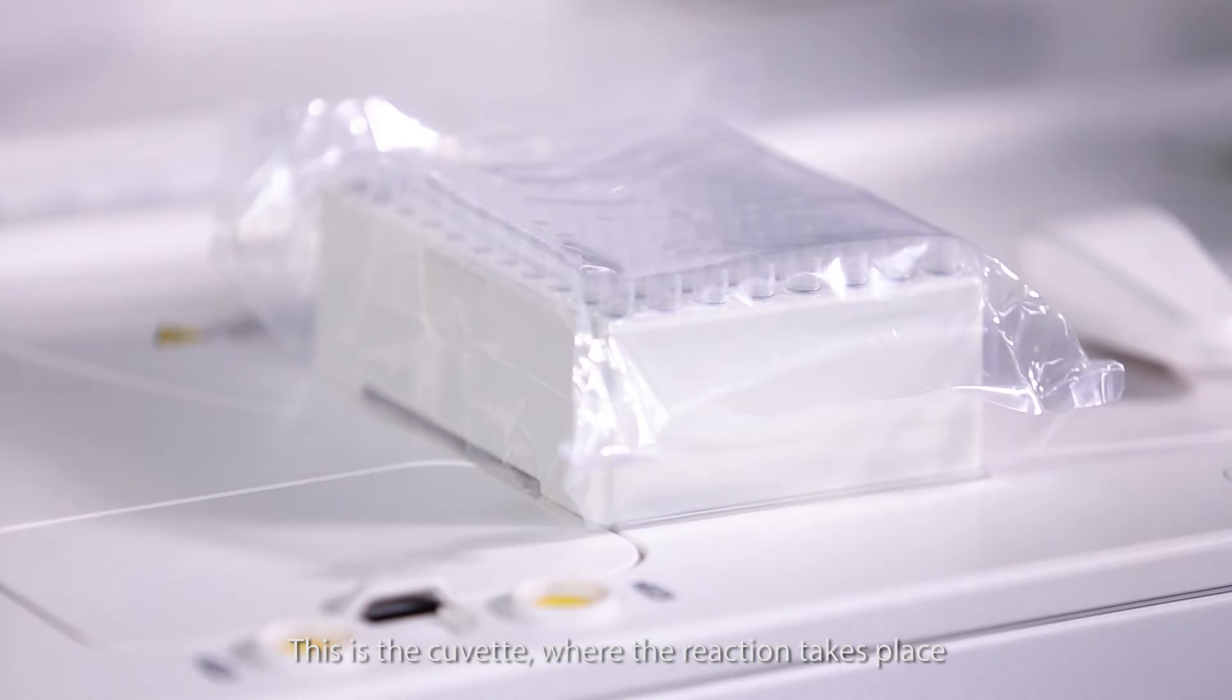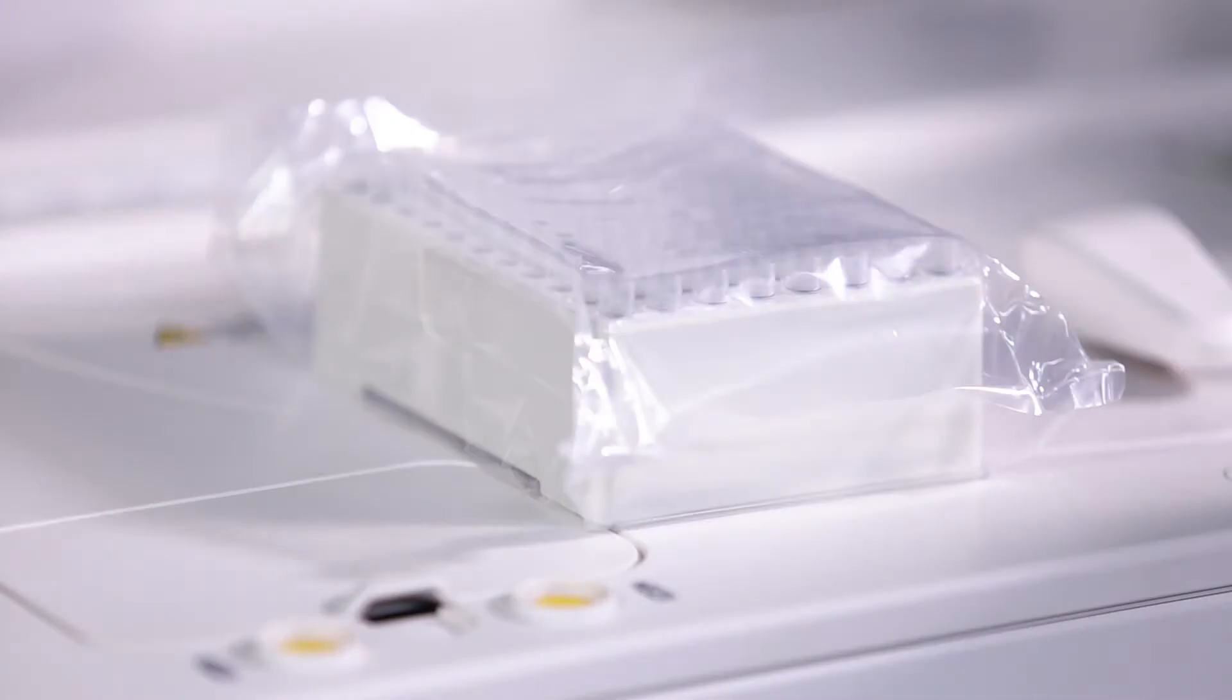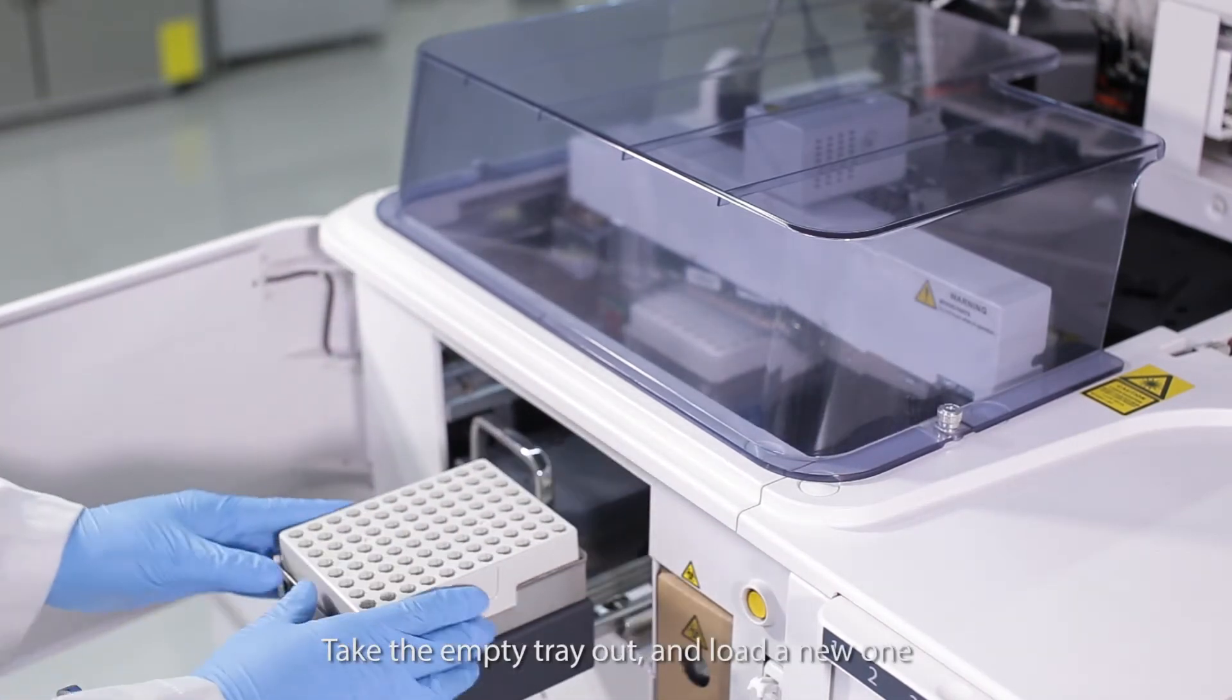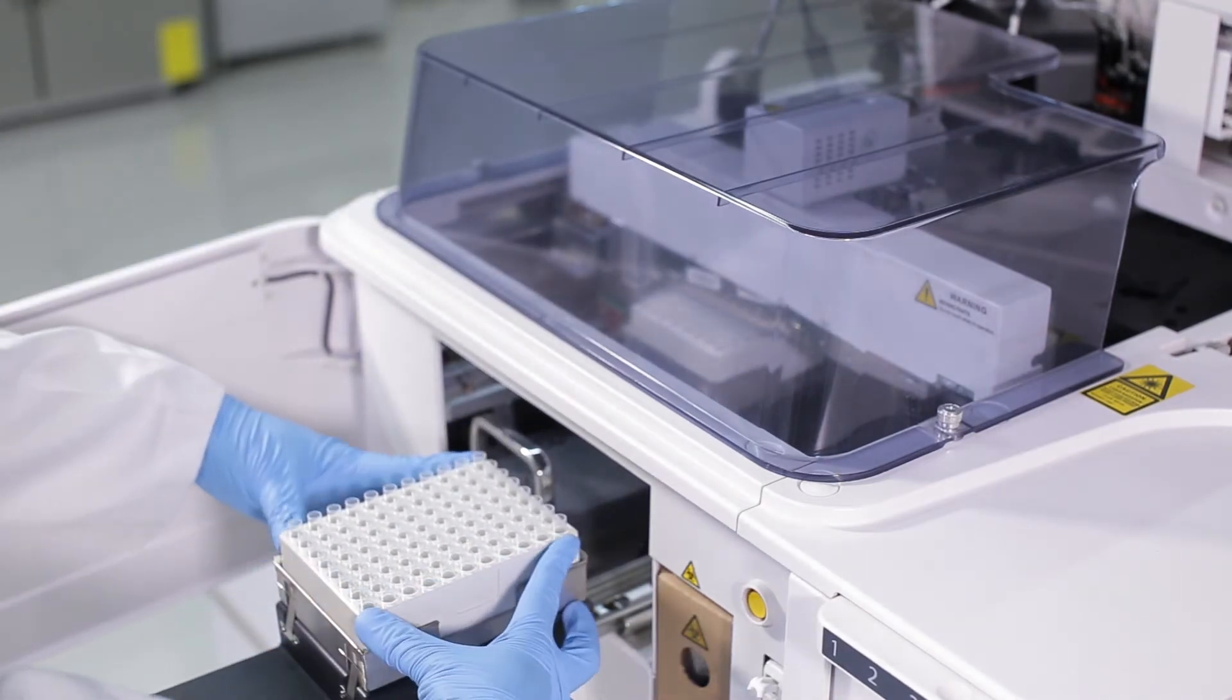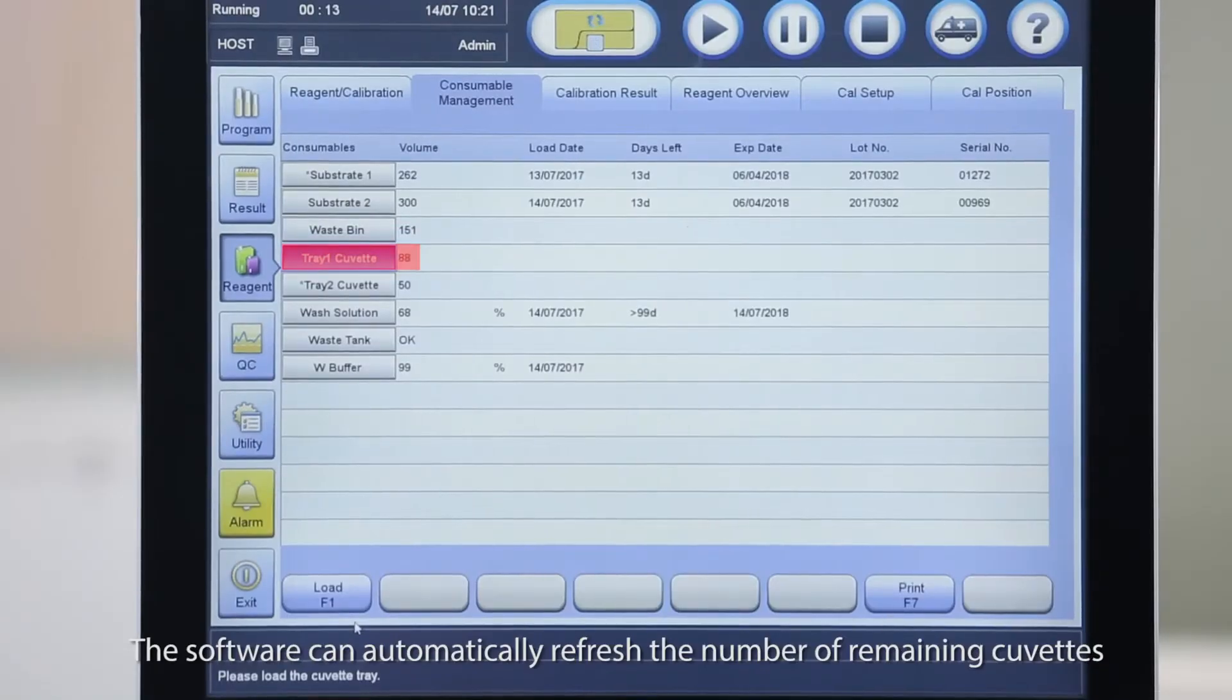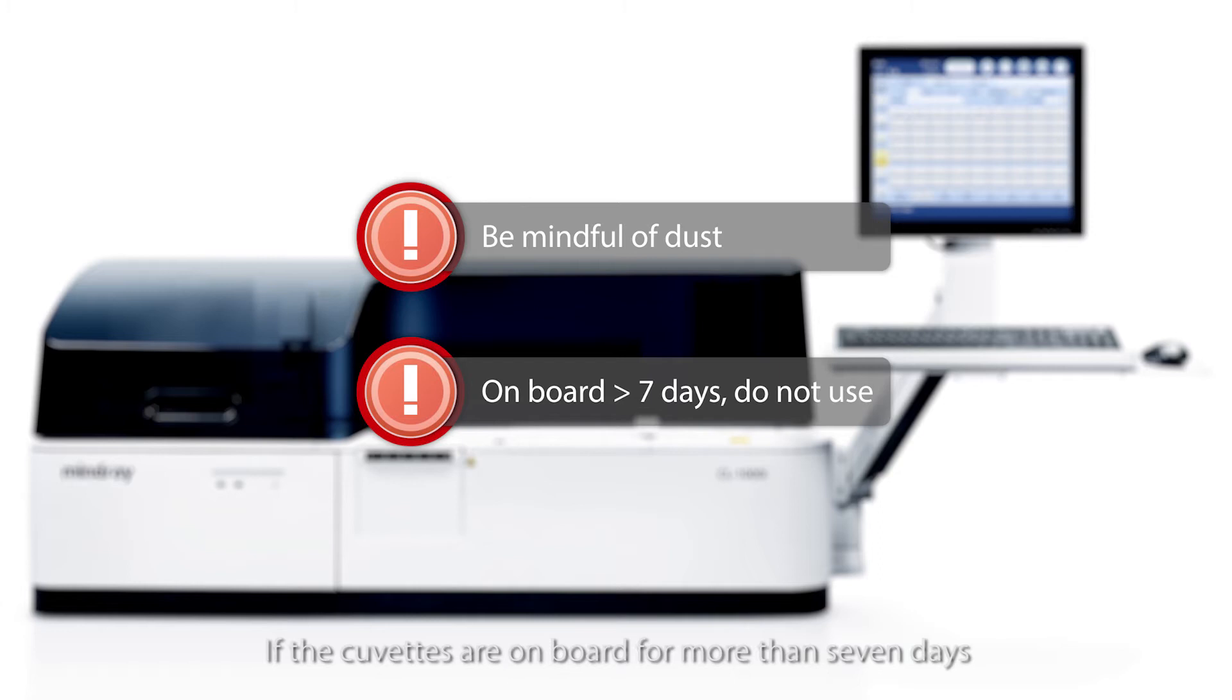This is the cuvette where the reaction takes place. Two trays of cuvettes can be loaded on the system. Cuvette inventory can be displayed by the software or the indication light. Open the package by the notch. Do not drop or contaminate the cuvettes. Open the door and pull out the tray rack. Take the empty tray out and load a new one. Hold the side of the tray to avoid contamination. Press the four corners to make sure the tray touches the bottom of the holder. Push the tray rack back in and close the door. The software can automatically refresh the number of remaining cuvettes. Be mindful of dust in case it influences the test results. If the cuvettes are on board for more than seven days, please do not use them.